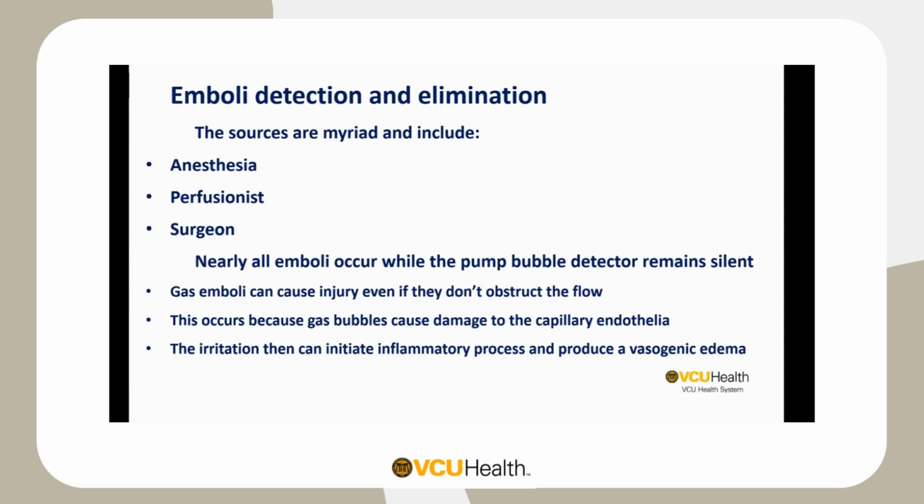So for cardiac surgery, the scenario of microemboli is very typical, and they cannot be detected by perfusion if they're very, very small, because detectors on the perfusion system are set to ignore microemboli.